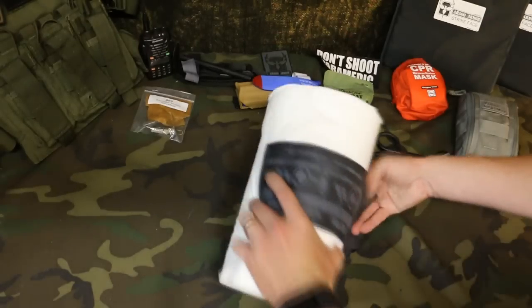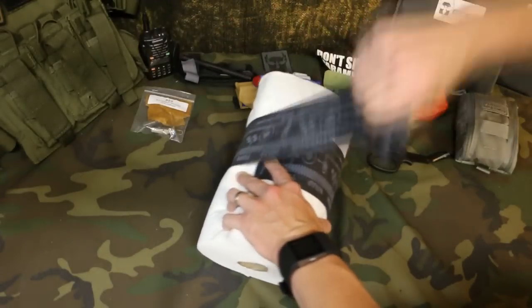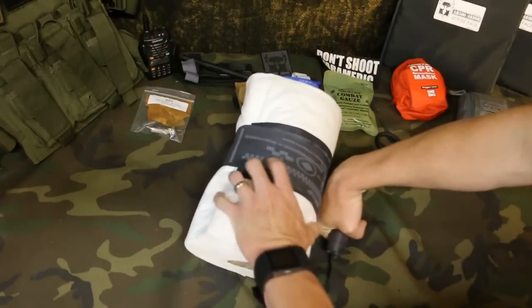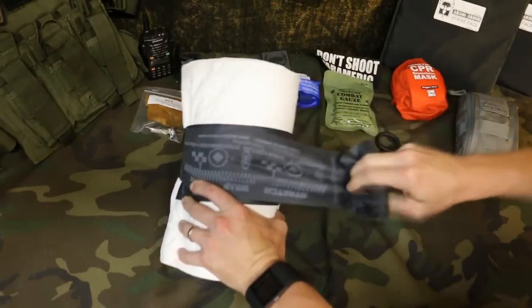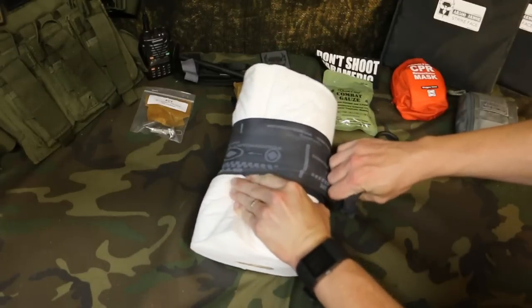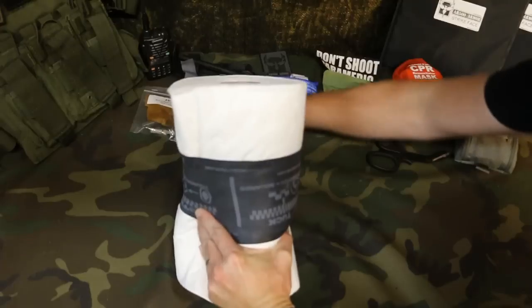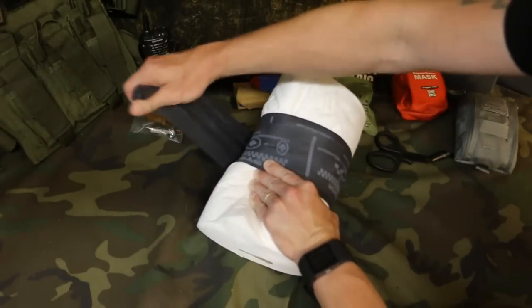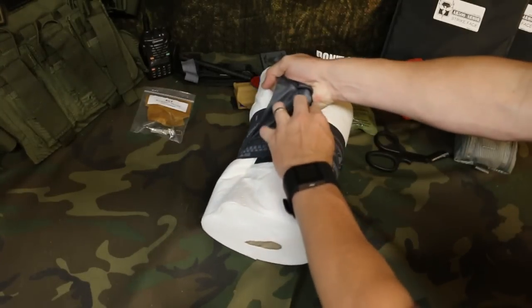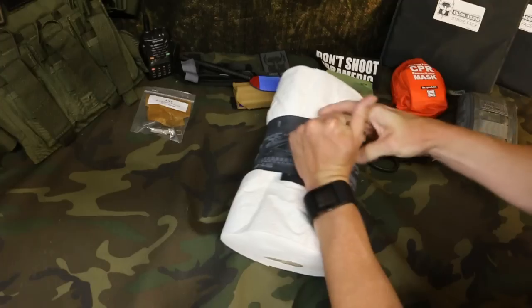Put your band on, your first rotation around, then come back across — that's going to hold it in place. Pull this really tight. You can now see that we have circles and we have squares. Come back around, pull it tight. If you need to, you can go a little bit wider. Try to keep it as smooth as possible. Once you get to your last band, you can either hold onto it or pull it back, and then tuck this in.